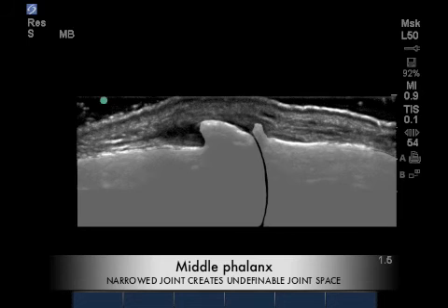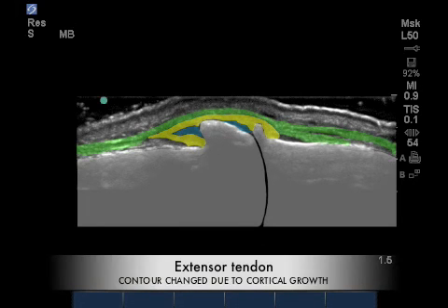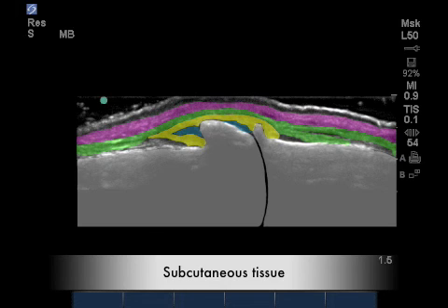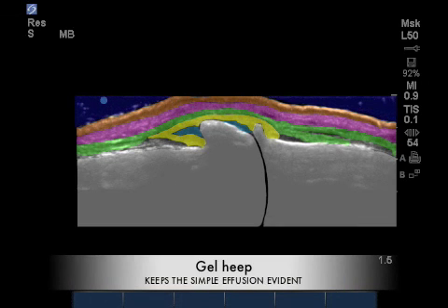These cortical growths make the joint almost impossible to see on a static image. In yellow is the synovial lining, which appears normal in thickness. Here we have a little excess joint effusion, and the extensor tendon appears fairly normal, as do the subcutaneous and cutaneous layers, so that we see the full extent of this growth and its effects on the soft tissue. Always remember to use a gel heap.